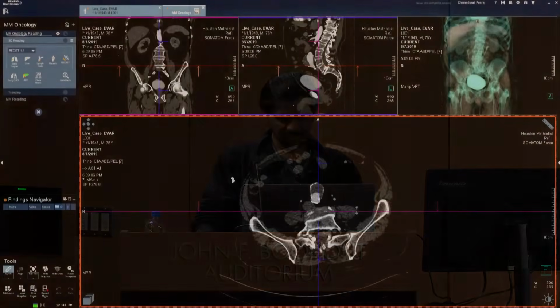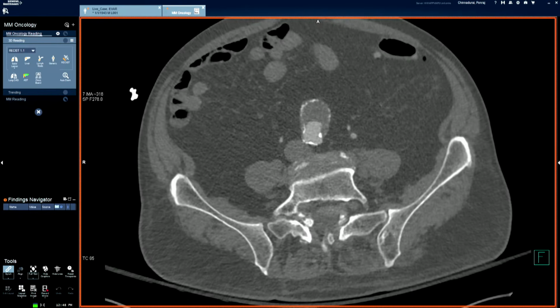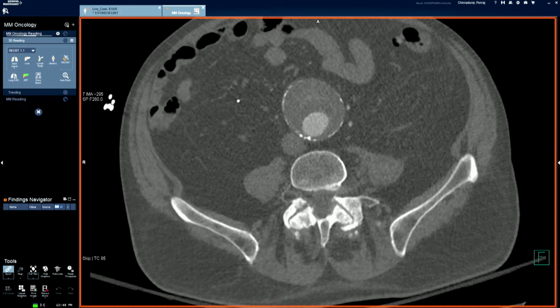Usually it stays there for 2 or 3 days. That high slice data is there, but it can be lost. What's on the machine is high resolution typically, but once they send it over, it depends on the institution. There have been places where I've worked where if you were more than a few days late asking for it, they could have already sent it as 2 millimeter slices and it was gone. You couldn't get back to that original data.